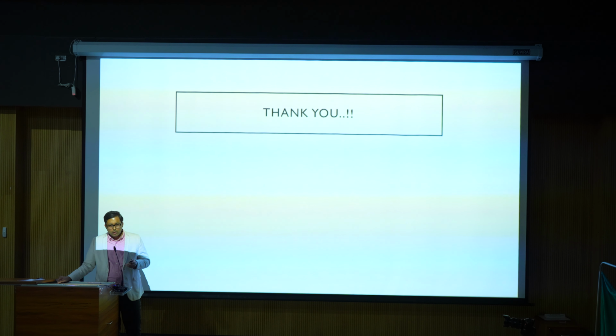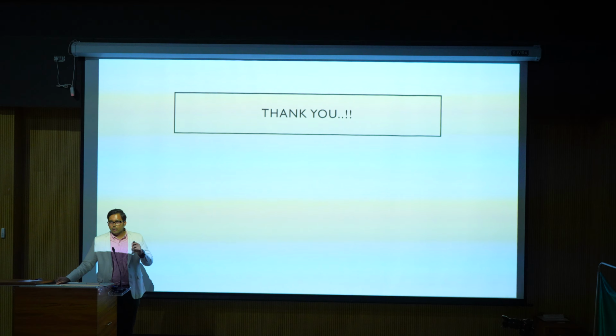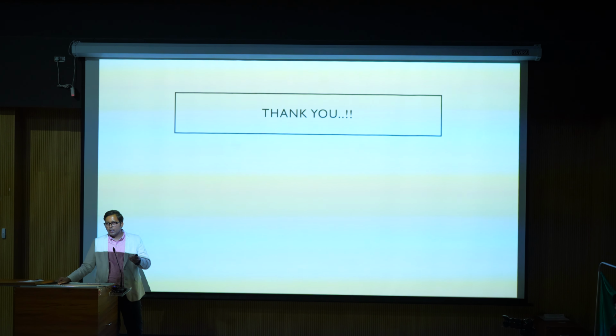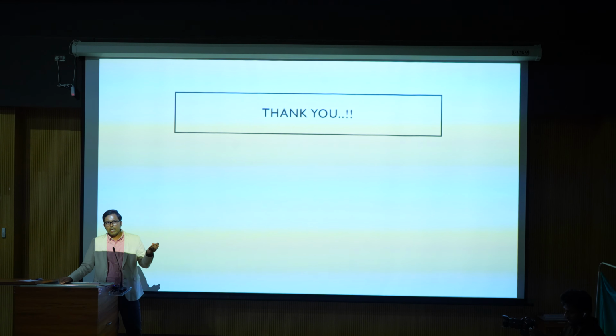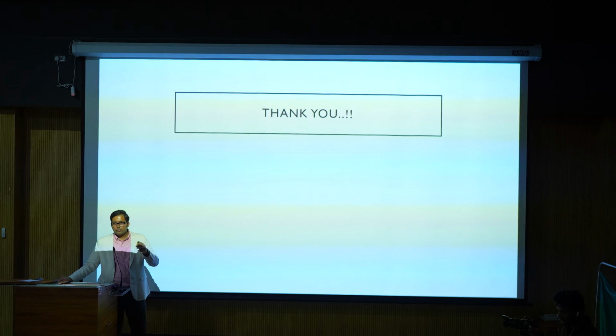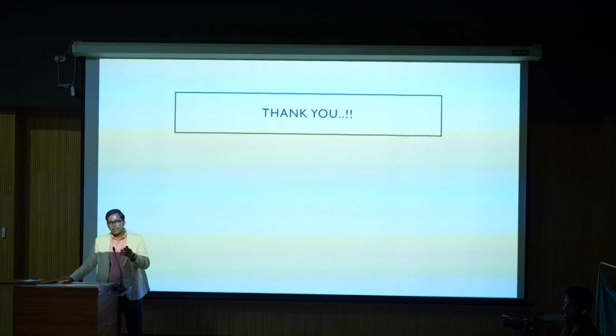Thank you very much. I know this is a new concept for most of you, but at least go through the terminologies. What is E wave? What is A wave? What is fractional shortening? What is MPI? How we actually calculate? First, see a lot of cases of the normal things. Try to apply these values and these methodologies in your day-to-day practice.